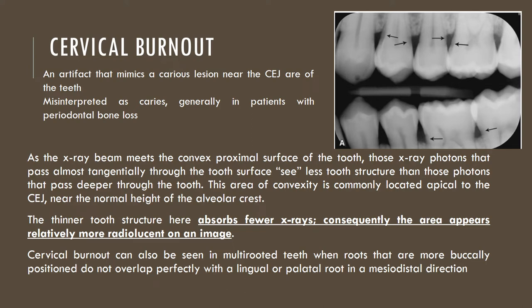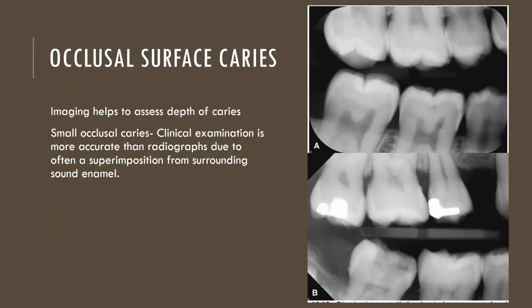Cervical burnout can also be seen in multi-rooted teeth when roots that are more buccally positioned do not overlap perfectly on the lingual or palatal root in a mesiodistal direction, often happening with the maxillary molars. When it comes to occlusal surface caries, these are best examined clinically. Imaging helps assess the depth of caries, but in case of small occlusal caries, clinical examination is more accurate than radiographs due to superimposition from surrounding sound enamel, as evident in image A where a very tiny occlusal caries on the first molar is nearly obscured by the thicker sound enamel. A larger caries is very easy to detect clinically and obvious on a radiograph because of greater tooth destruction.